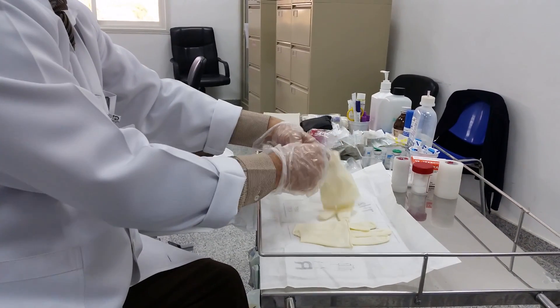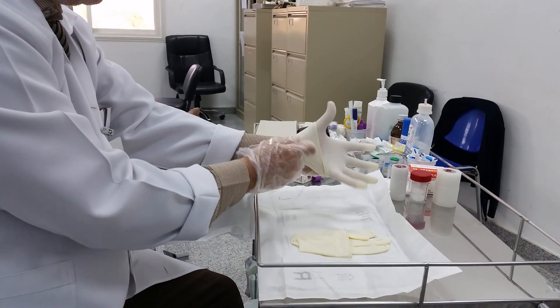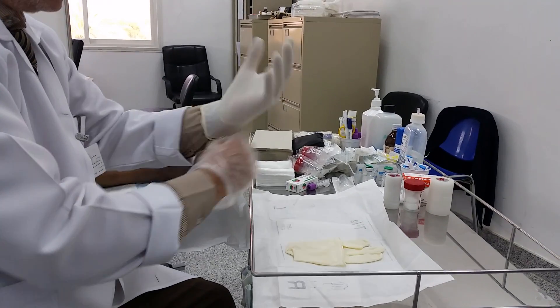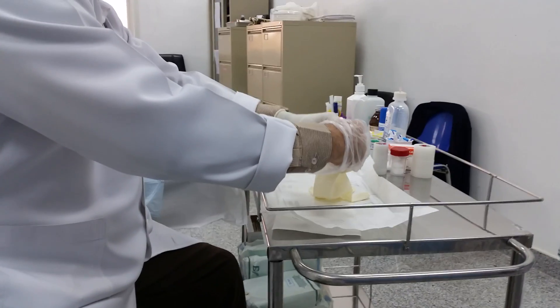We have aspirated the left knee last time, and now his left knee is okay. Today he has a large effusion — it is synovial proliferation. As we see on power Doppler.